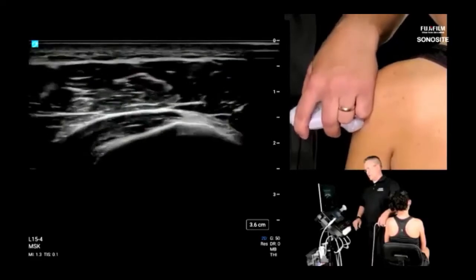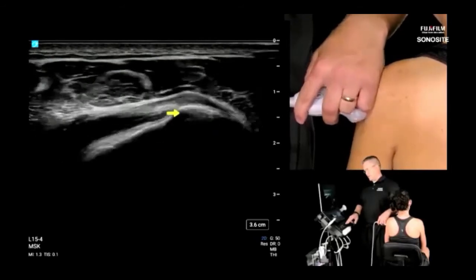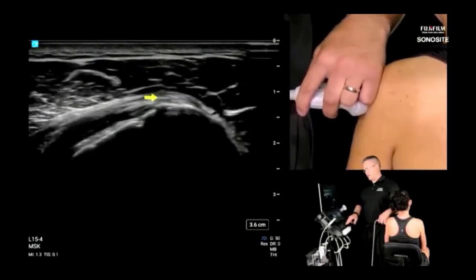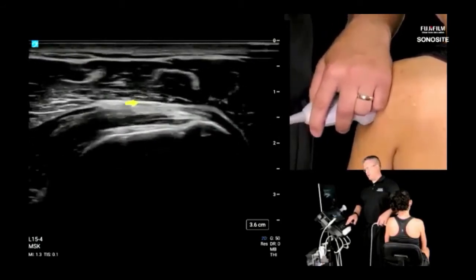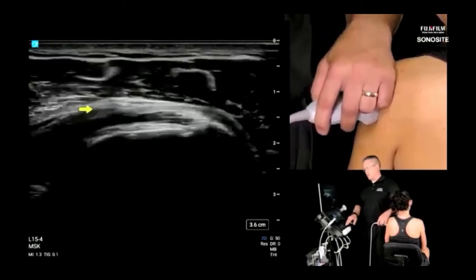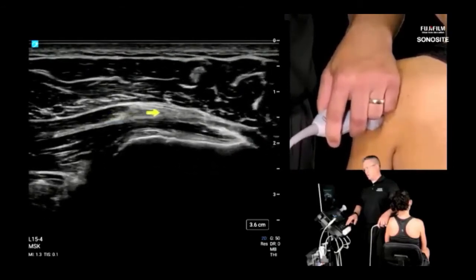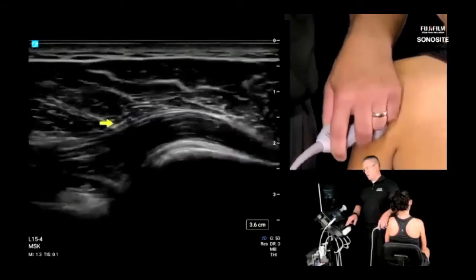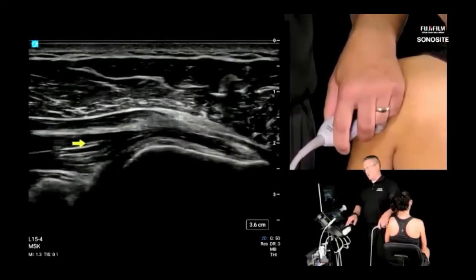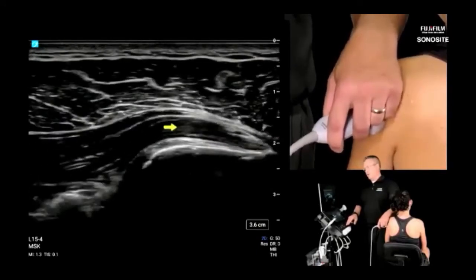If you've ever scanned a knee, the pes complex looks a lot like this too. So here's our arrow. This is the enthesis right here of the tendon. And now let's follow that enthesis proximally, and then you'll see how shallow the tendon is relative to the rest of the muscle. It stays right up on this top surface of the rest of the muscle. Here we go. Okay. Hopefully that helps, but yeah, there's a lot more in depth to scan. The teres minor is just thinner. Right.